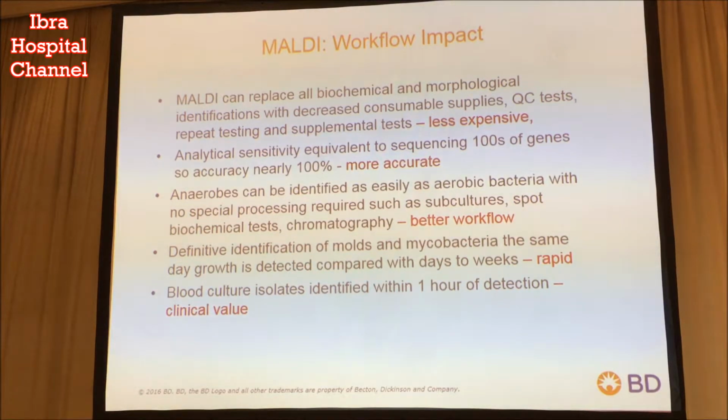The analytical sensitivity is actually equivalent to sequencing hundreds of genes, so the accuracy approaches virtually 100%. The reason I say it's equivalent to sequencing genes is because what you're going to do is see a series of protein peaks, basic protein peaks, that are extracted and detected using the technology.